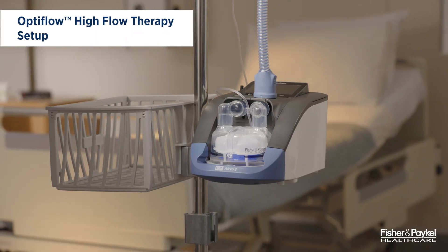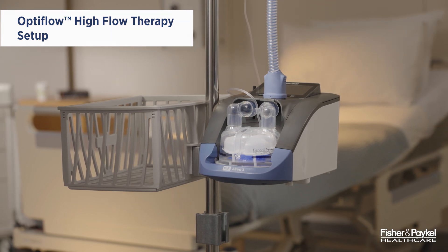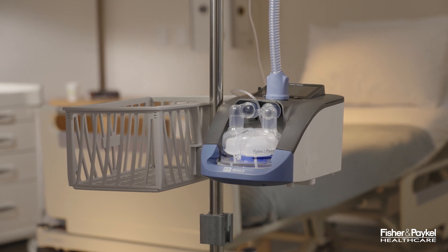The Airvo 3 series is designed to deliver Optiflow High Flow therapy to spontaneously breathing patients. This video will demonstrate the setup for Optiflow High Flow therapy.